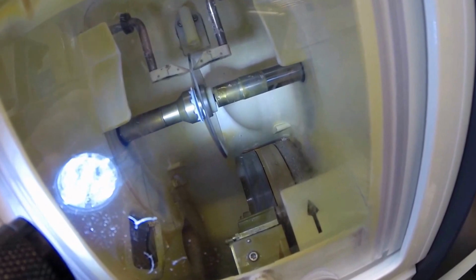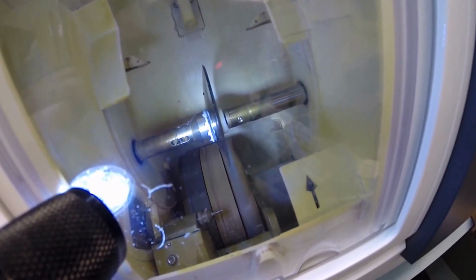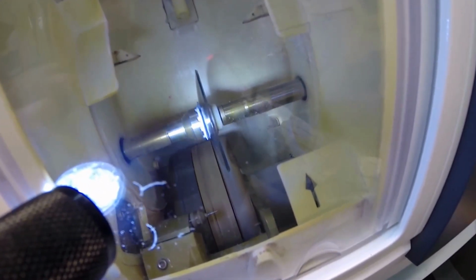And doing the old carpenter saying, measure twice, cut once, it's measuring the thickness of the lens at every point to know exactly, precisely where to place the bevel so you have the least amount of edge thickness showing. Now you do not have a strong prescription, so you will not have any edge thickness, but it does become critical because I do cut strong prescriptions all day long, and that does come more into play.